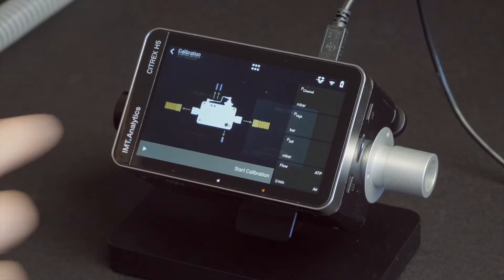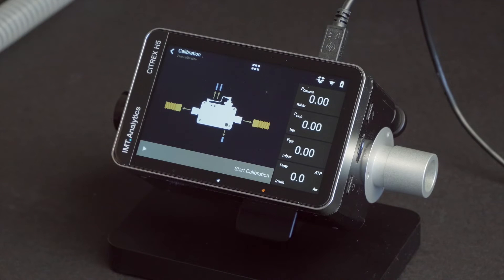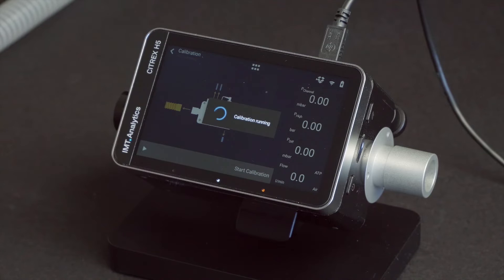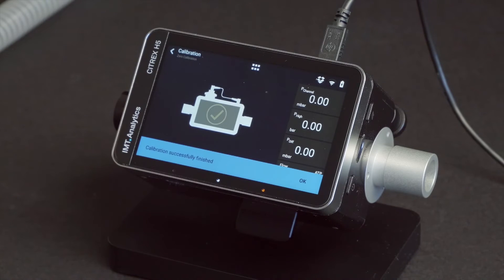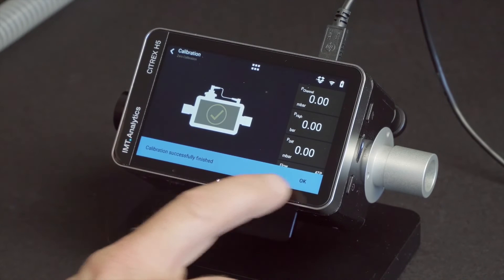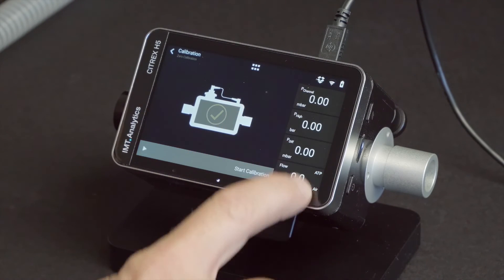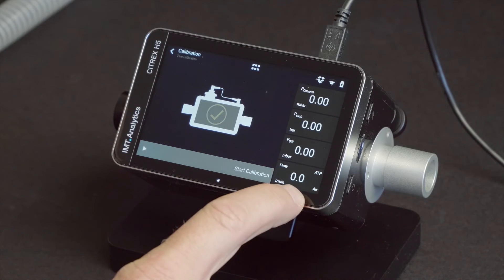Tap the zero offset icon. Tap start calibration. It needs only a few seconds and the zero calibration is done. After successful calibration, a confirmation message appears. All values are now calibrated successfully. The device is now ready for use.